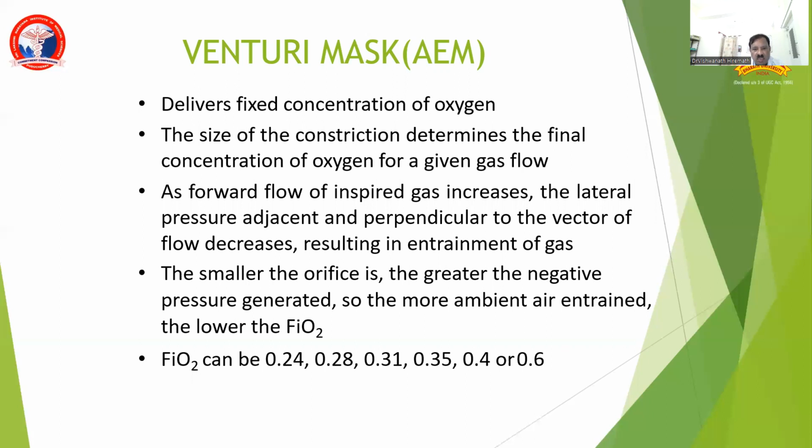The smaller the orifice, the greater the negative pressure generated, so more air entrainment occurs and the lower the FiO2. FiO2 can vary from 24 to 60%.